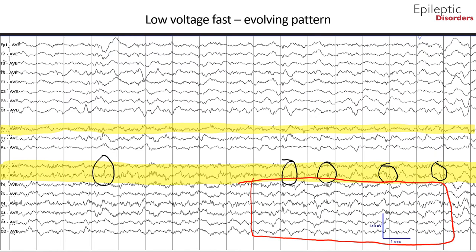In the average montage of the same page, there is a clear field outlined in yellow with FP2, F8, and frontal midline FZ regions involved. Note also in the F8 region there is a sharp wave embedded within the fast activity, outlined by the black circles. This sharp wave becomes more apparent as the seizure evolves and progresses, especially towards the end of the page.